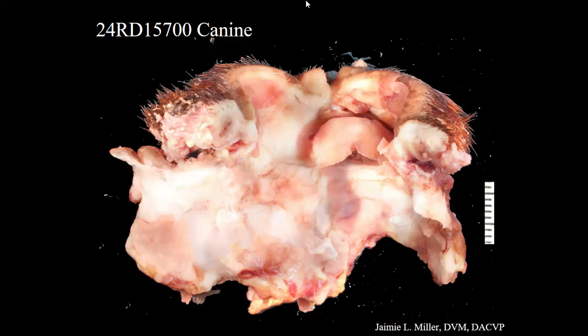this is tissue from a 4-year-old male-neutered Doberman Pinscher, who back in July of last year was a dog at a rescue society, and the complaint at that time was bilaterally symmetrical conjunctival thickening. They had a suspected diagnosis, and they sent biopsies in to us, and we confirmed their diagnosis, which I will withhold until we look at the slides in a little bit.